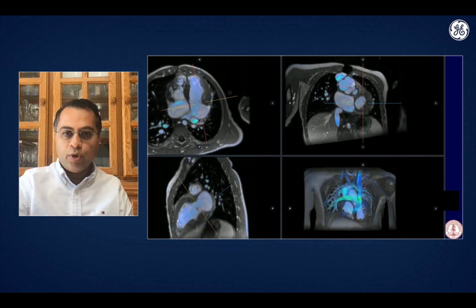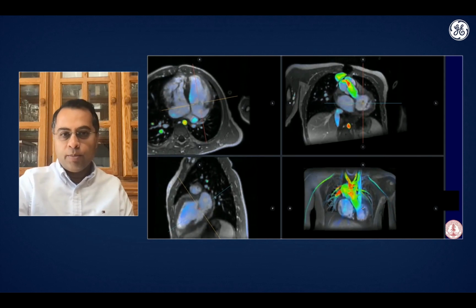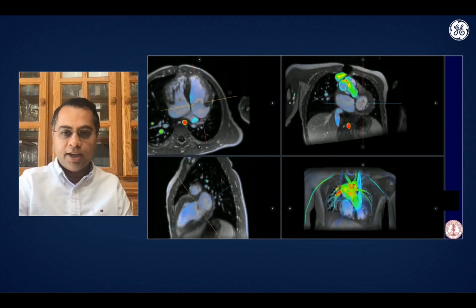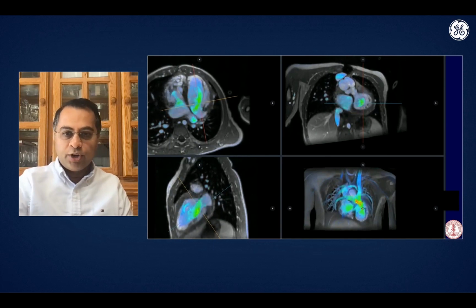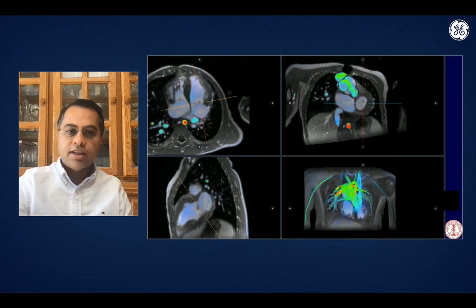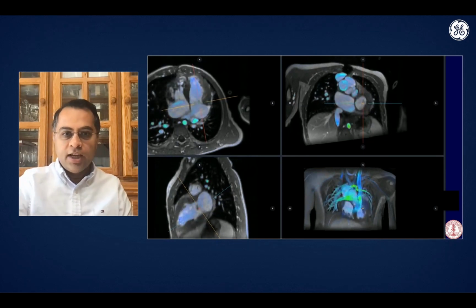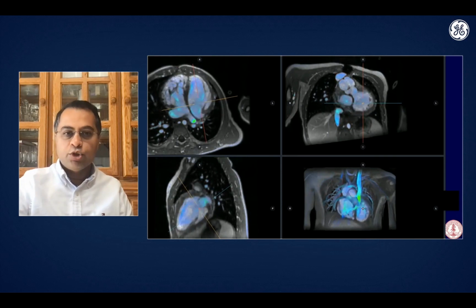As you can see, after you get a volumetric scan that covers the whole chest, after the fact, you can retroactively reformat images into any plane you want. So for example, here you see in the bottom right the rendering of the whole chest, but then in the other panels, the standard views that are in the valve plane, the 4-chamber view, and also a 2-chamber view.